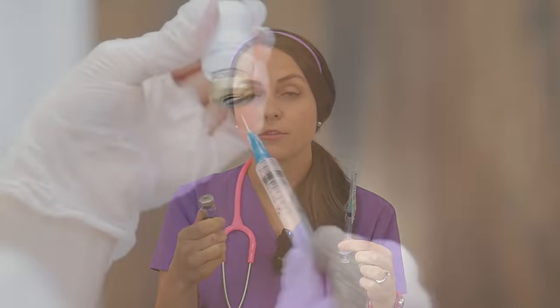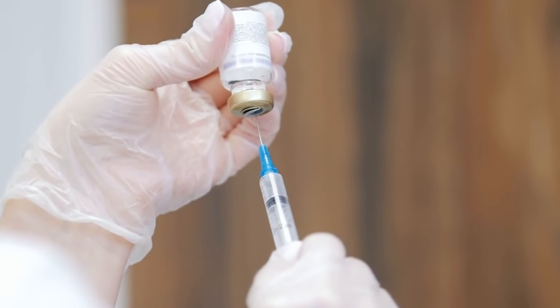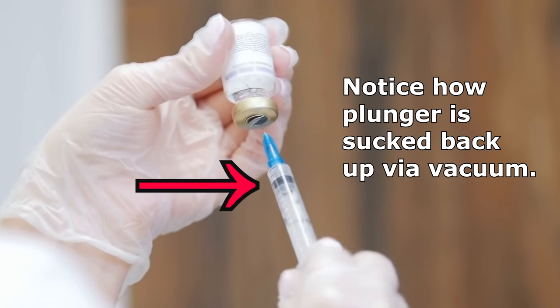While that is drying, take your syringe and instill air in it, because you're going to inject that air into the vial prior to removing the medication. Why do we want to do that? We want to prevent a vacuum from forming inside the vial. If not enough air is injected prior to removing the medication, it will be very difficult to withdraw — especially true for multi-dose vials. You're going to inject the same amount of air equal to the amount of medication you're removing. Our order says two mls, so we'll inject two mls of air and then remove two mls of medication.